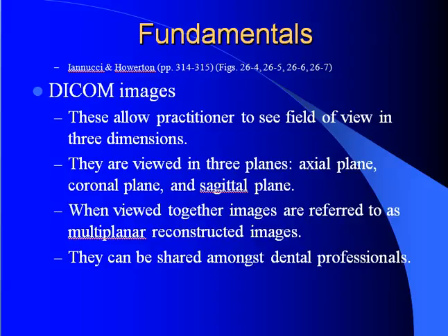Digital Imaging and Communications in Medicine, or DICOM, is a standard for handling, storing, printing, and transmitting information in medical imaging. It includes a file format definition and a network communications protocol.